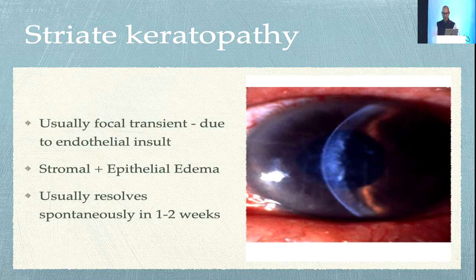So this is one of the common ones, right? On the first postoperative day, you often see this kind of transient edema, and a lot of people tend to put hypersol kind of drops.